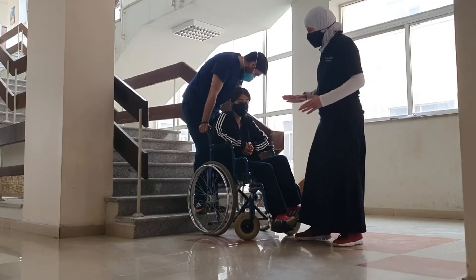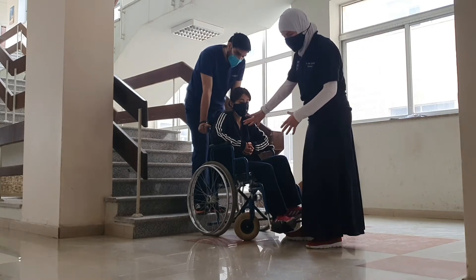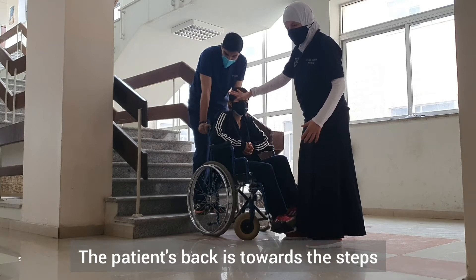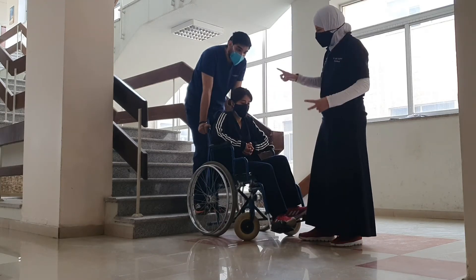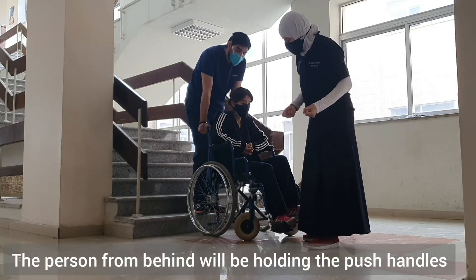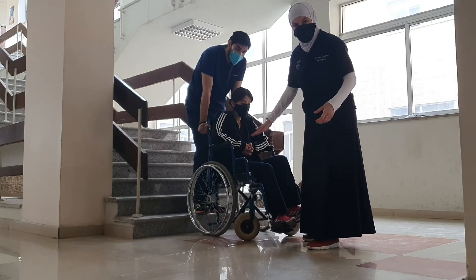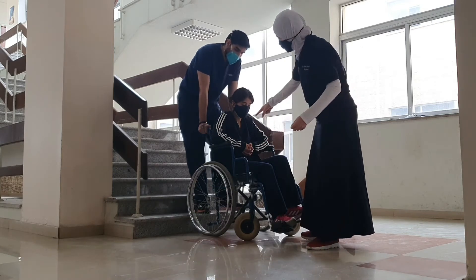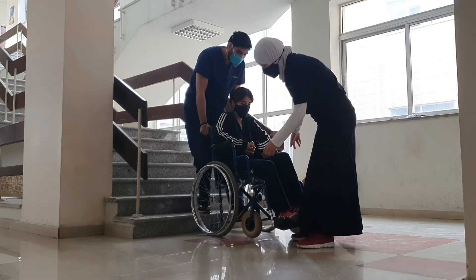For this technique, if the person is going up a step, they need to move close to the step with their back towards it. We are demonstrating with two people assisting. The person from behind will be holding the push handles, and if the person on the wheelchair can do a wheelie, they will do it. The person can assist by pressing on the tilt tab and making a wheelie.